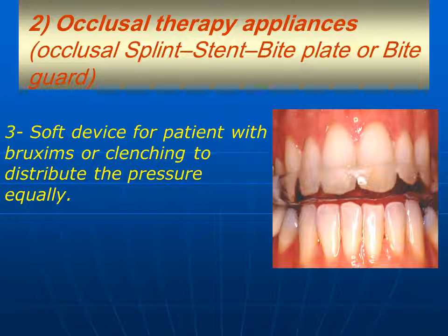Also, we can use soft devices for patients with bruxism or clenching to distribute the pressure equally between the teeth and protect the teeth from the effect of bruxism.